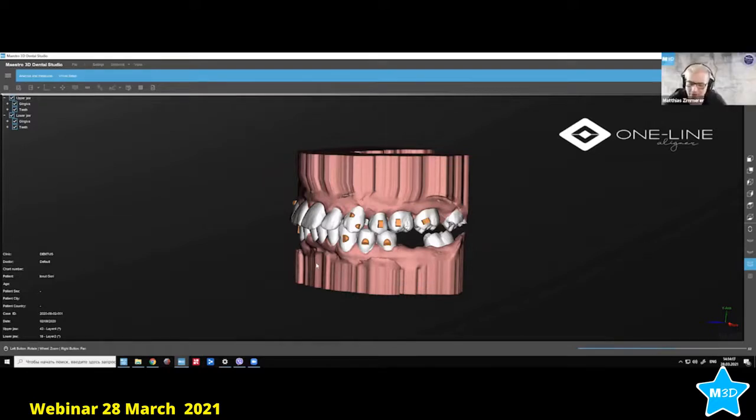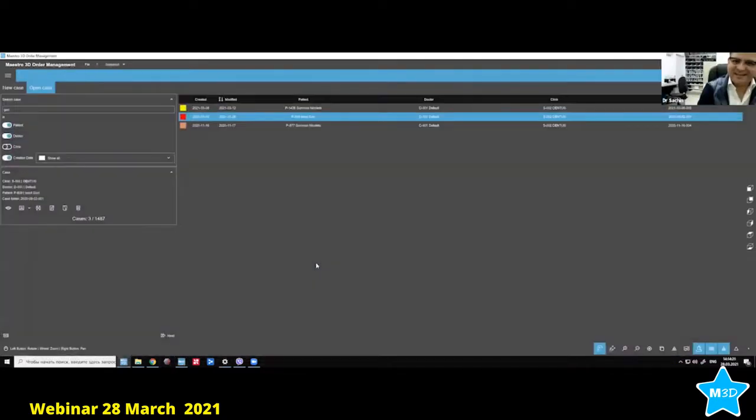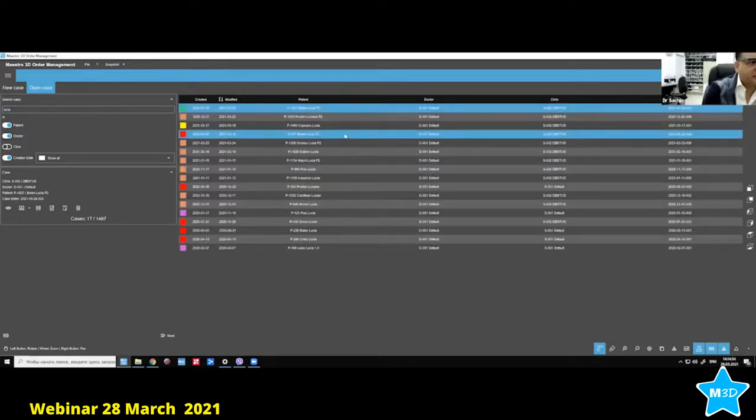It's a very crazy case for Linus, I have to say. Yes, I have crazy cases. I have crazy cases actually. So I can just show you one more case also.